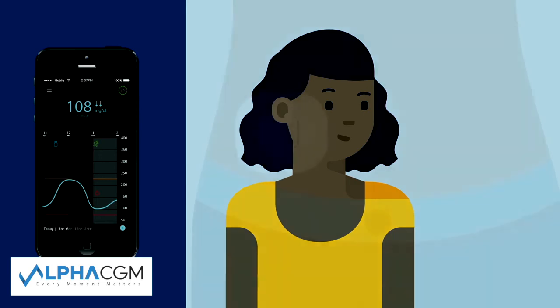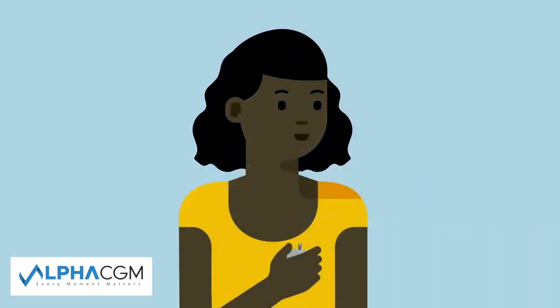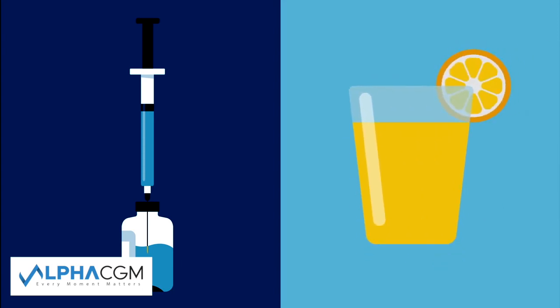Your CGM system can alert you on your high and low glucose values and show you the speed and direction that your glucose levels are moving, giving you time to take action if needed. Keep in mind, CGM does not replace BG meter readings. BG readings are still needed to keep your CGM system working properly. It is also necessary to confirm your sensor glucose with a BG reading before making any treatment decisions, such as giving insulin for a high BG or treating a low.